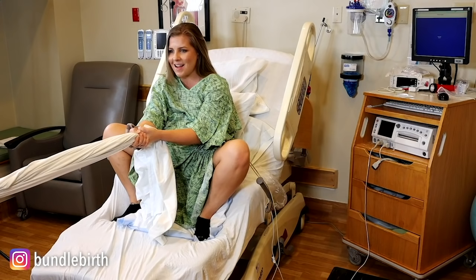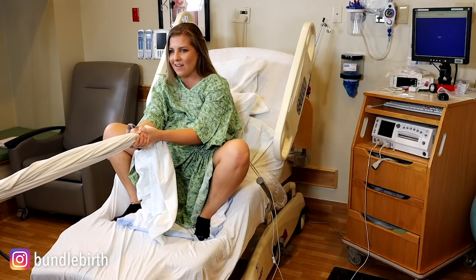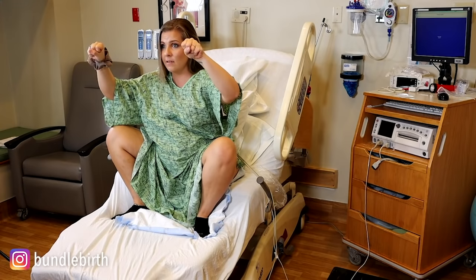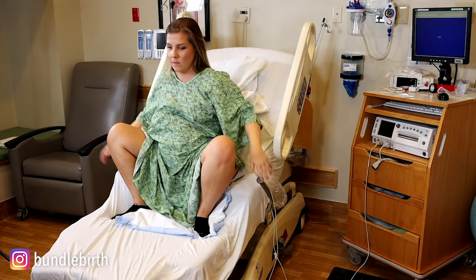My knees are wider than my feet here. Don't obsess about this, but if you're a nurse or really trying to learn this stuff, ideally that may not work as well — but again, don't fix what's not broken. If I had a squat bar, it would be about right here, and that could help stabilize you in more of a squatty position.